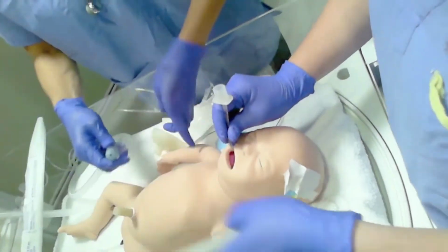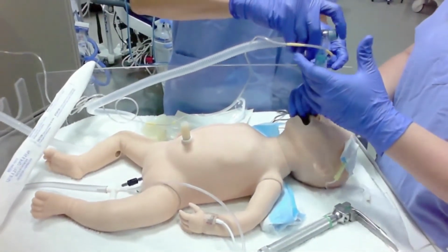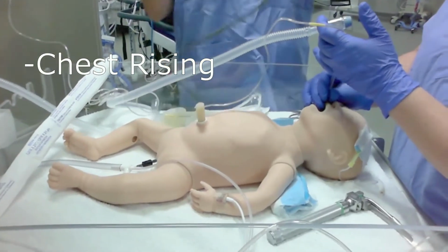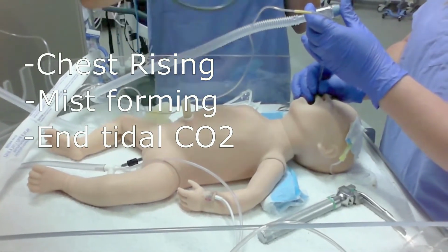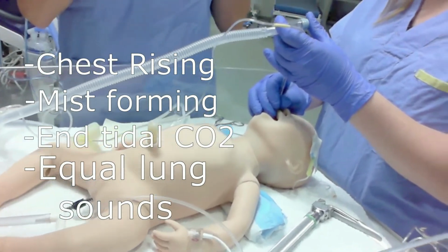Once inserted, the tube is connected to the ventilator, and various indicators are used to confirm the tube position. Let's listen in. I see chest rise. I see misting in the tube. I see end tidal. I hear equal and bilateral air entry.